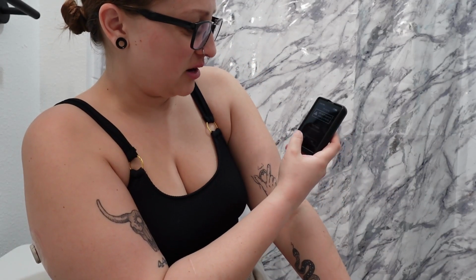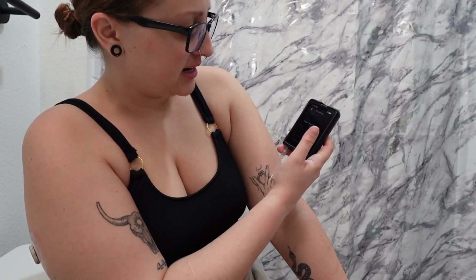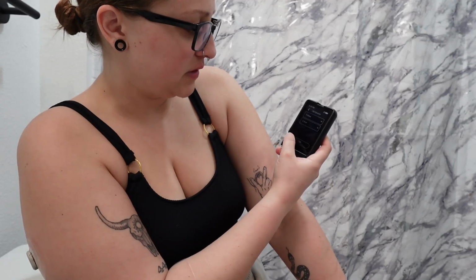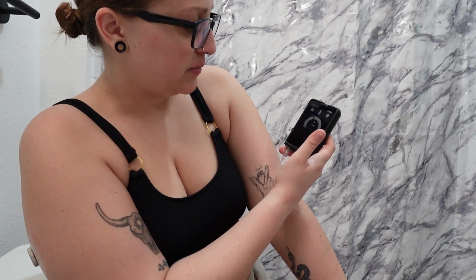So do you see drops? Yes. Do you also need to insert a new infusion set? Yes. Insert infusion set. Next, and fill the 6mm Teflon. Resuming insulin delivery. Perfect. We're all good, all set. I feel so much better, and now we can go eat something.